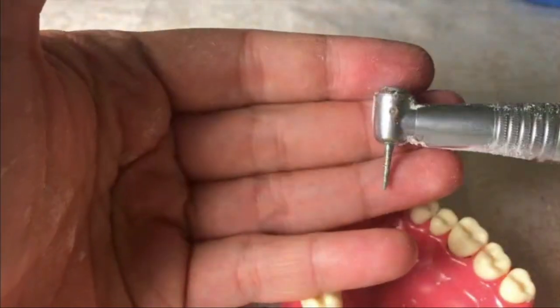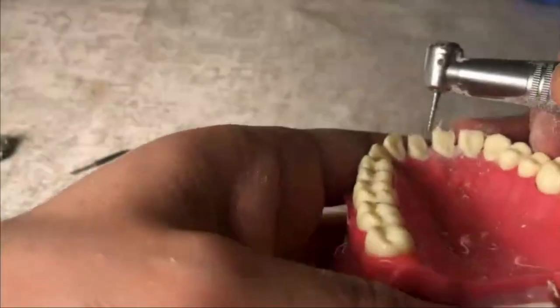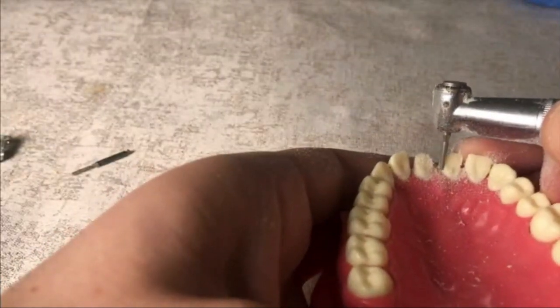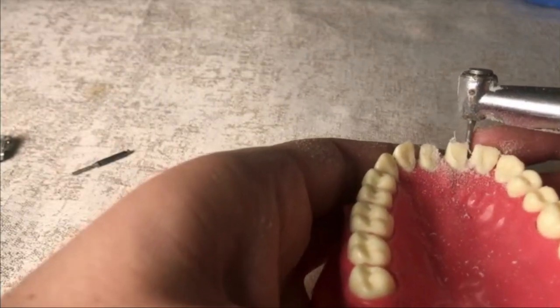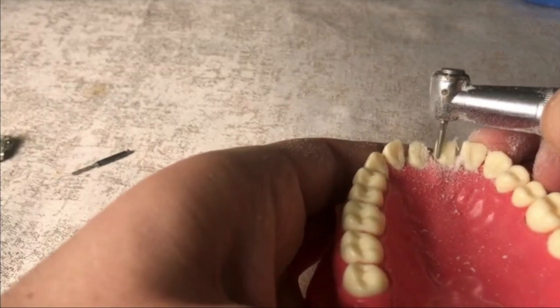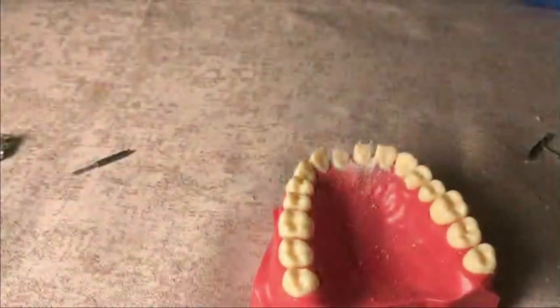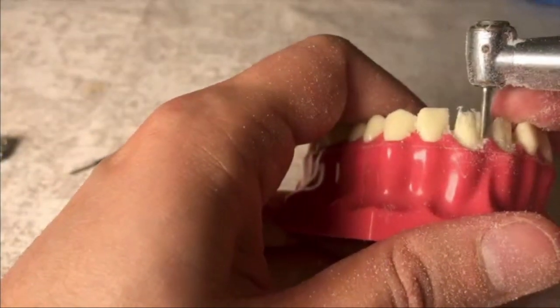I insert a tapered burr and make a taper angle of 3 to 6 degrees on the axial walls. Finally, I make the final corrections with a red or yellow banded cylindrical shoulder burr.